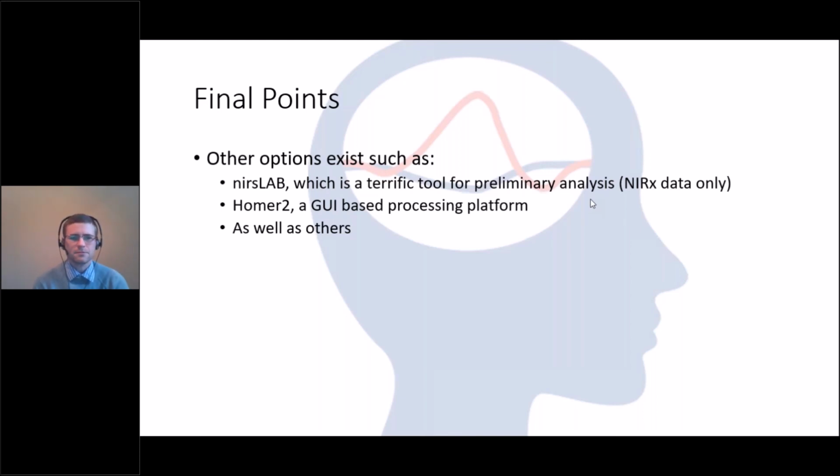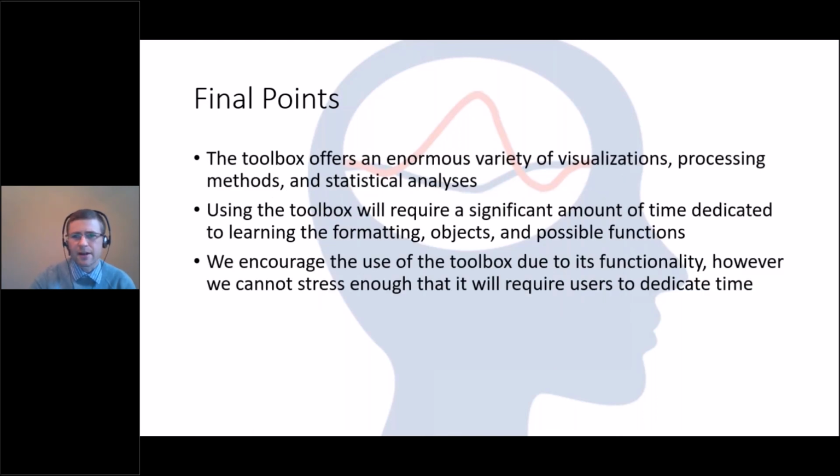All right. The last one is from, excuse me, I missed where is the screen? Yes. So where can we find the residual error and beta 0 after GLM? It seems there is no such result. I believe there's a standard error.